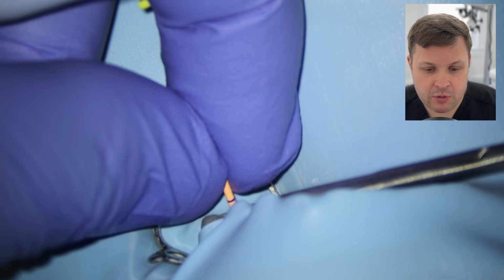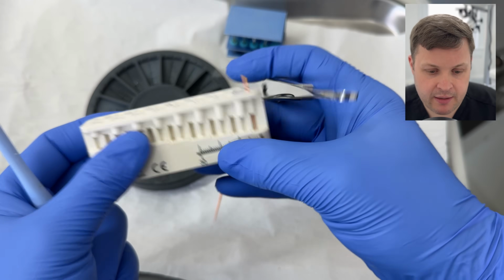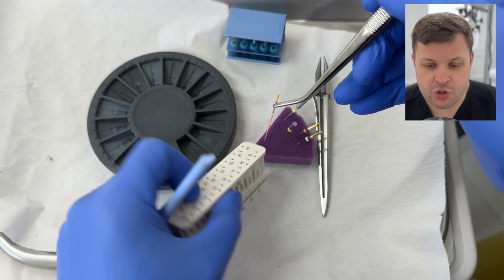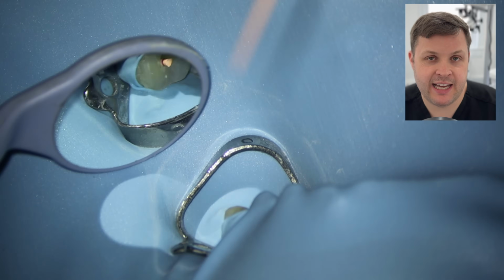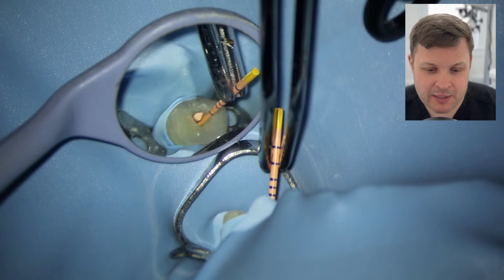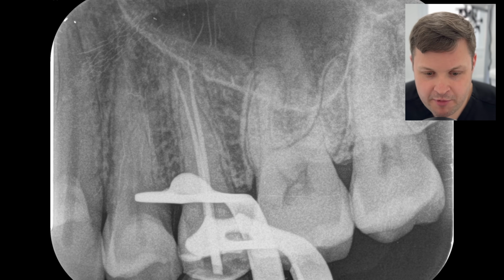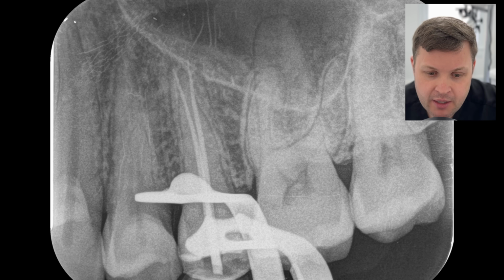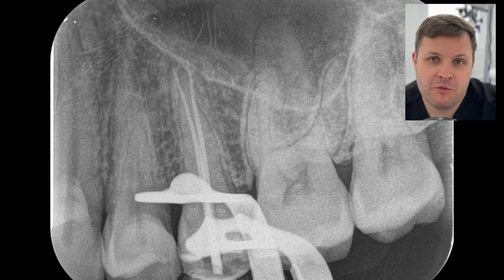Once we've placed the buccal cone, we're going to measure again the palatal, which is 19.5 millimeters. And we, again, do the same sort of process. We're going to fit it really nicely to length, get a little bit of tug back, and then snip off the excess. And when we look at the cone fit radiograph, it looks really, really nice. Now it's obvious that there are 2 canals. They're at the working length. And we've got a really nice narrow taper. So I'm happy that we're ready to go for our final obturation.